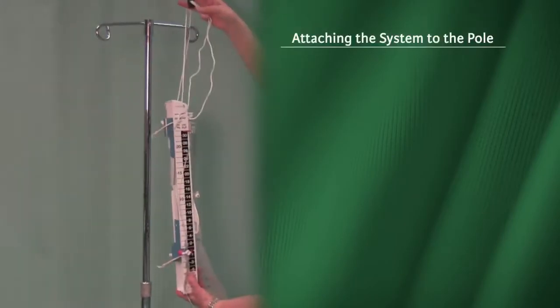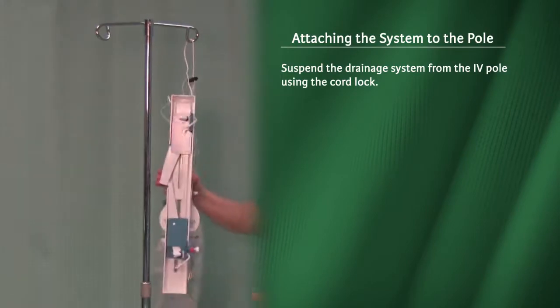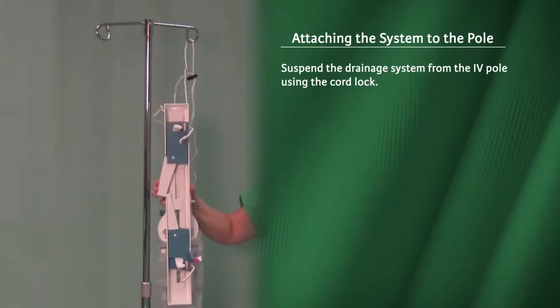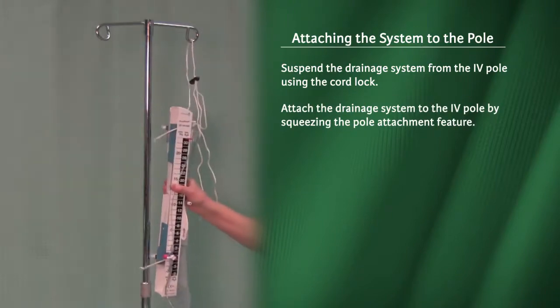Attaching the system to the pole. Suspend the drainage system from the IV pole using the cord lock. Attach the drainage system to the IV pole by squeezing the pole attachment feature.